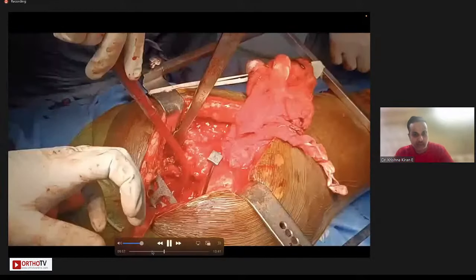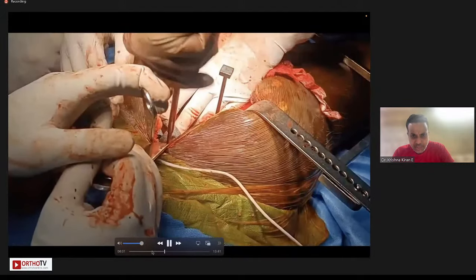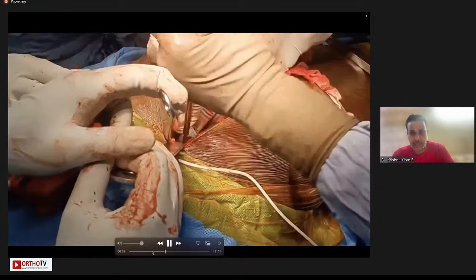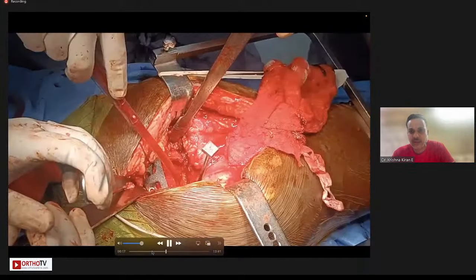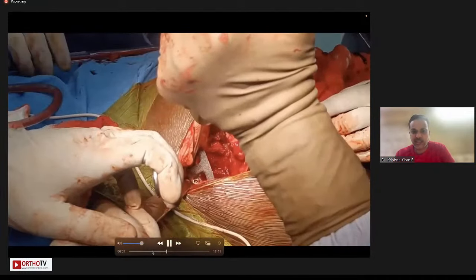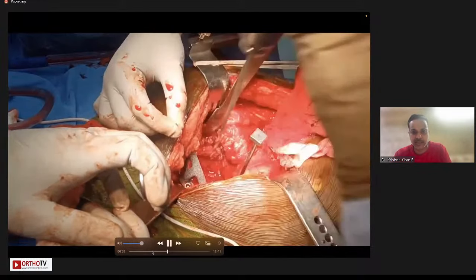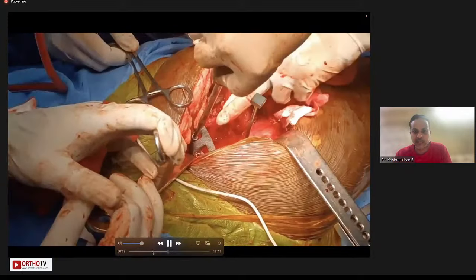So you have these augments. These are provisionally fixed with a screw and a K-wire. And then you can ream between the augment and the residual host bone to fine tune the final size of the socket. And in all these cases, what we do is we use a cup which has the ability for inferior fixation because we see there is no superior bone for fixing the socket. So you need to fix into the ischium, you need to fix into the superior pubic ramus, and then you use a cup which is cemented in the correct position into this particular cup. So which is either a trabecular metal revision shell or the Redapt cup which has a pre-drilled inferior locking screw in the direction of the superior pubic ramus and the ischium.